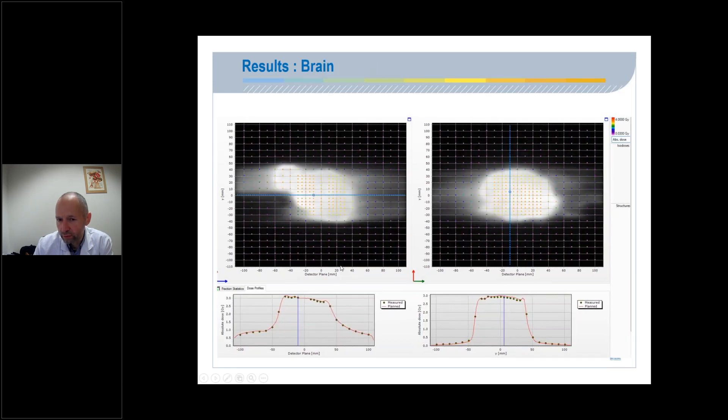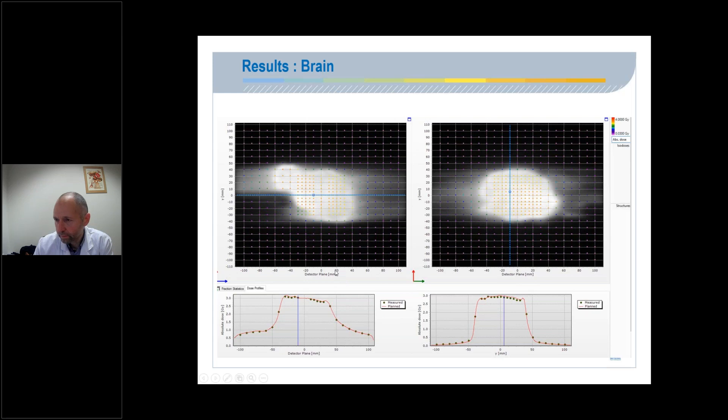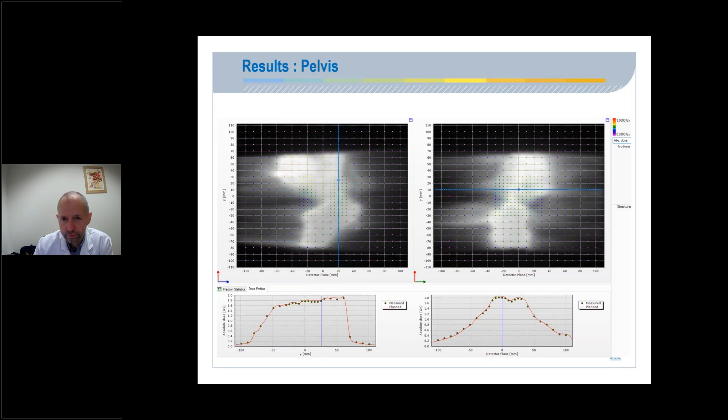For the brain, we obtain similar results in all profiles, vertically and horizontally. And for the pelvis, we have also good profile and good agreement between measured and planned dose. We can conclude that the junction area is quickly taken into account by the TPS and by the machine. Here, this is the rear area of the junctions.